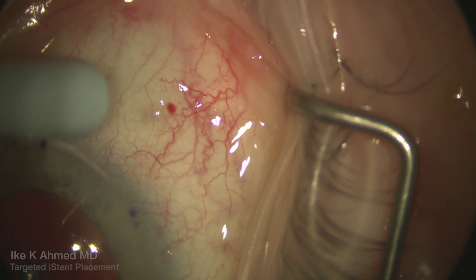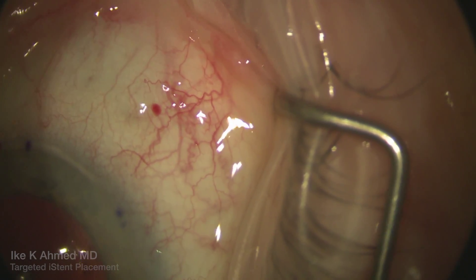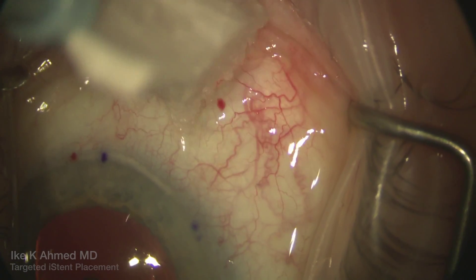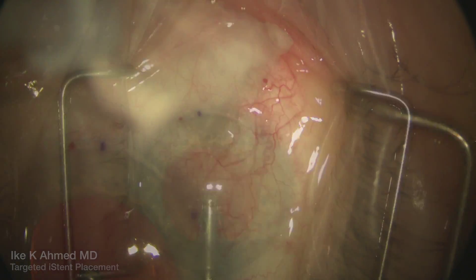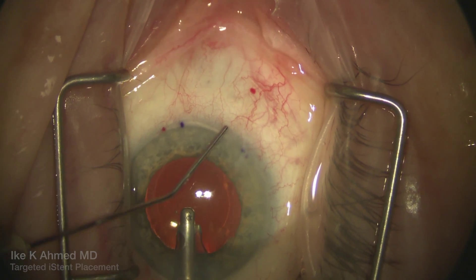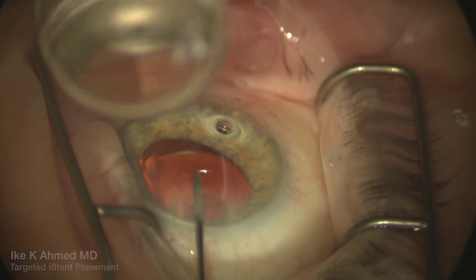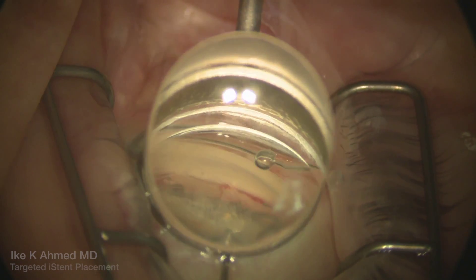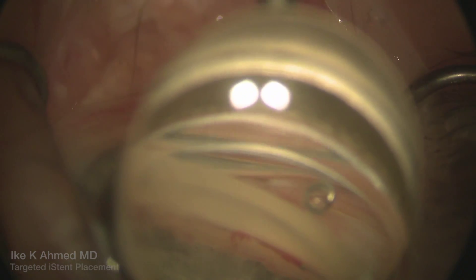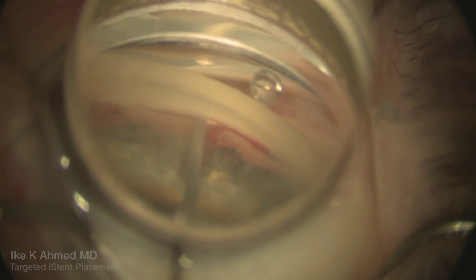In these cases, positioning we feel is important. We are going to say maybe we should place that device a bit more nasally, where there does seem to be a tributary vein that meets up with that larger aqueous vein. So here we are going to go literally about a clock hour or so away from the initially placed eye stent.